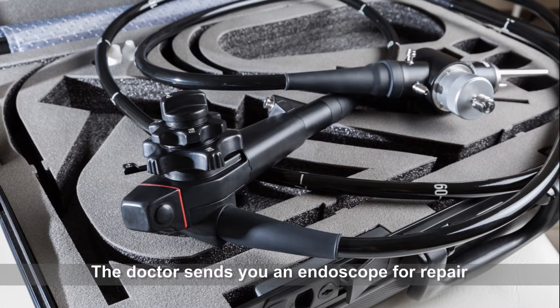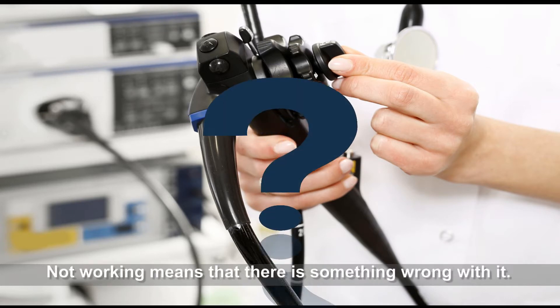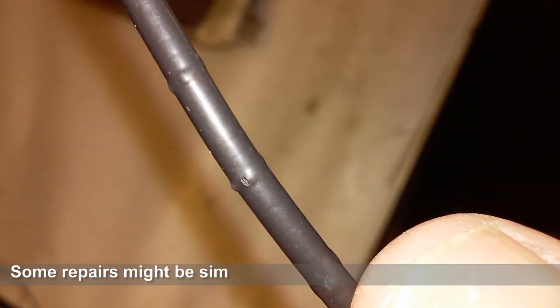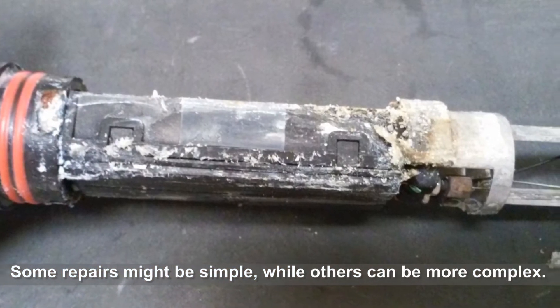The doctor sends you an endoscope for repair and all he says is that the scope's not working. Not working means that there's something wrong with it. Then you will need to find the problem and fix it. Some repairs might be simple while others can be more complex.